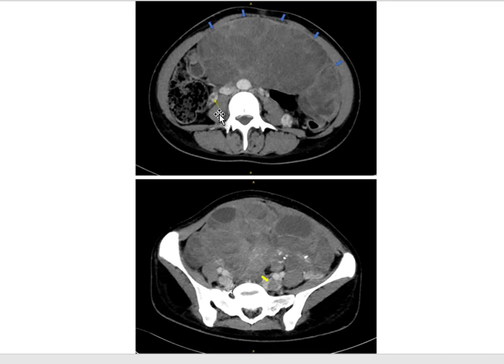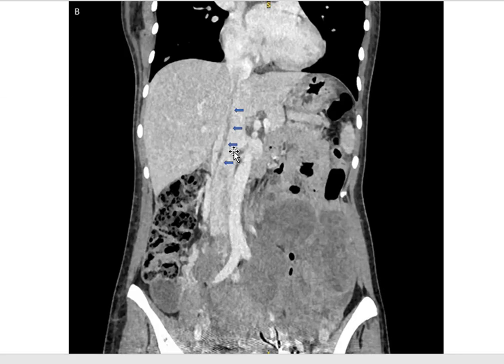Here we have the right ovarian vein and left common iliac vein. It also has extensions to the larger vessels, the inferior vena cava. And I am thankful to Esin, a former radiologist and now our pathology resident, for helping me with the interpretation of these radiologic images.